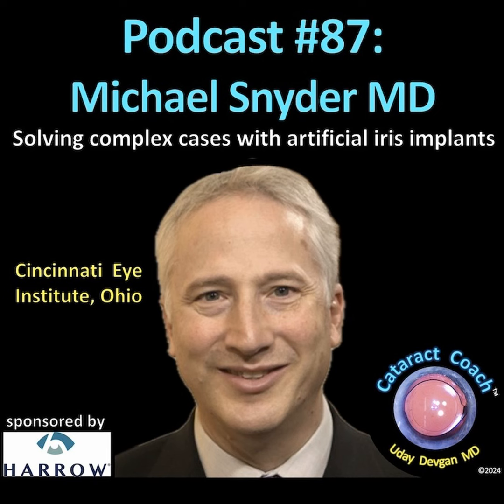Right. Now, is it just me, or are we seeing an increase in late bag IOL complex dislocation? Well, I think what we're seeing is greater human longevity. Right. And patients who are having cataract surgery at earlier ages. So our success rates just get better and better and better. And so now our threshold for interventions has gotten a little bit lower.